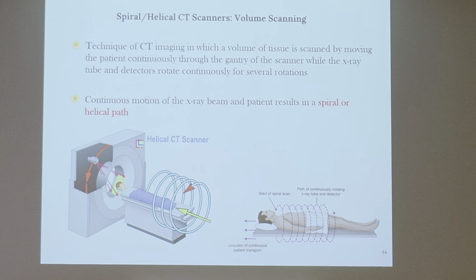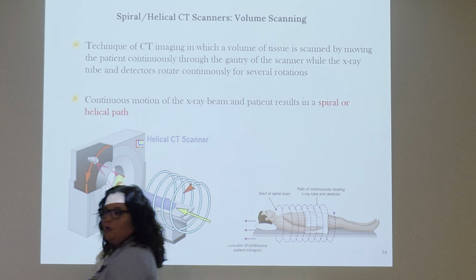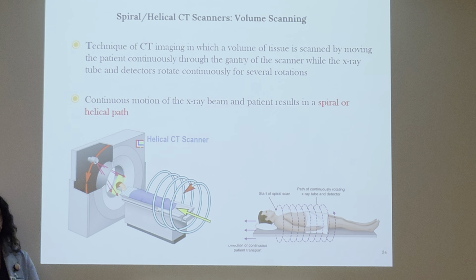Everybody's going to show you differently when you go in with different techs. I just went right there, because you're going to get that volume imaging. You just want to make sure your scan region covers what you need to cover and a little bit beyond, because again, those axial images are going to be what? Reconstructed.